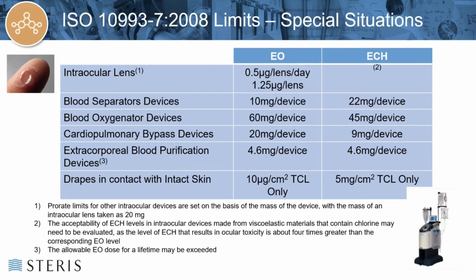As you can see from this table, many of these devices are allowed higher levels of EO or ECH residues. This is based on the exposure risk versus patient benefit from these types of procedures.